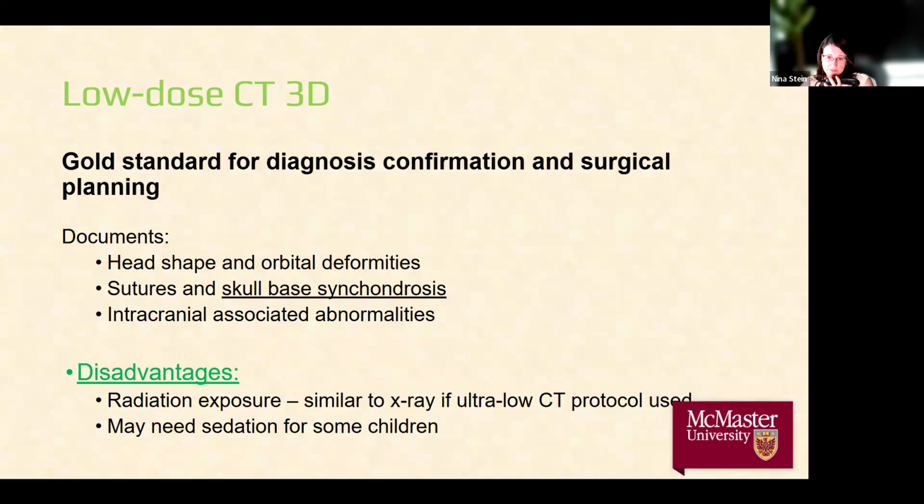Obviously, the disadvantage is that it does have radiation exposure, but if you have good equipment and optimize your protocols enough, you could use an ultra-low-dose CT protocol that is much lower than a normal head CT.